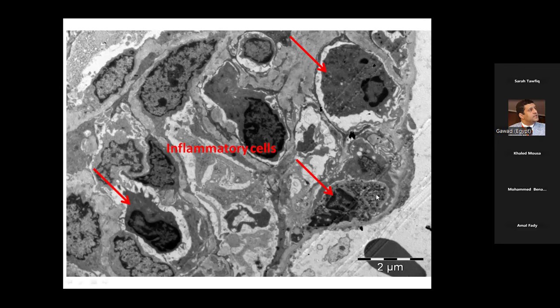These are the lysosomes that they use to get their proteolytic enzymes and induce the inflammatory reaction and so on in the pathogenesis of the diseases. Okay, these cells are inside the capillary lumen. This is the remaining part of the empty lumen, the lumen occluded now, and this is the remaining empty area in the capillaries. Okay, it's clear.